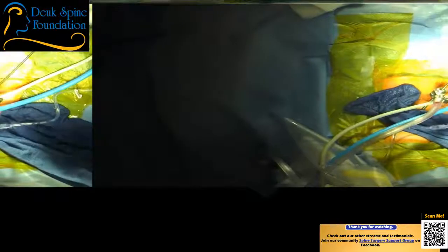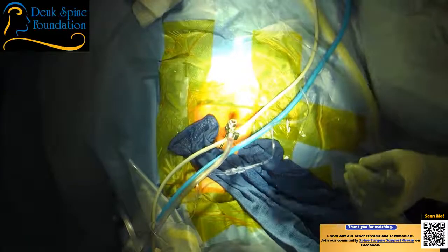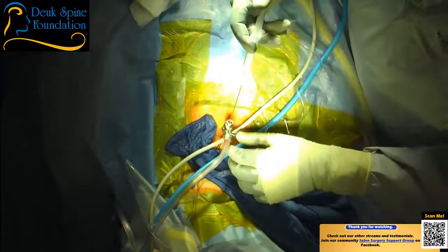So she had two herniations. The 6-7 is the worst. We just finished that one. Next is 5-6. We're going to do the 5-6 next.